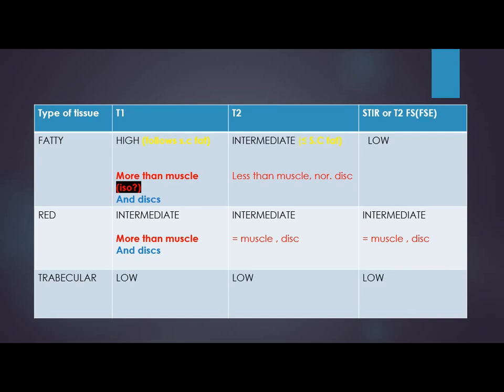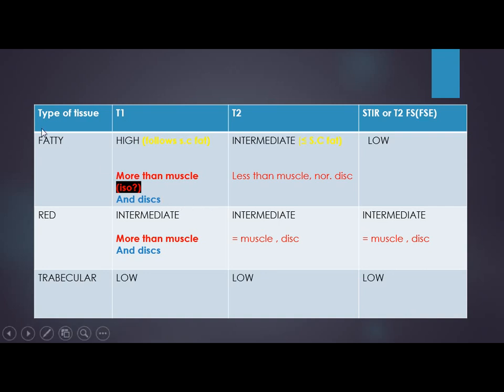In more detail: on T1, fatty marrow is high signal — similar to subcutaneous fat — and should be more than or isointense to muscle, but should never be below muscle signal. Red marrow on T1 is truly intermediate; it should also be more than muscle or isointense to muscle and normal disc. If red marrow signal is less than muscle on T1, it is abnormal.